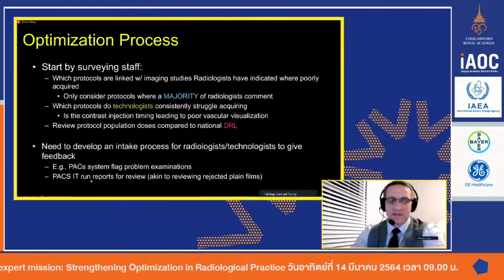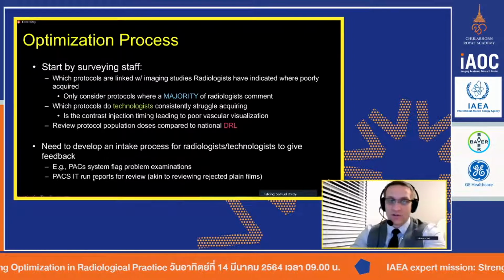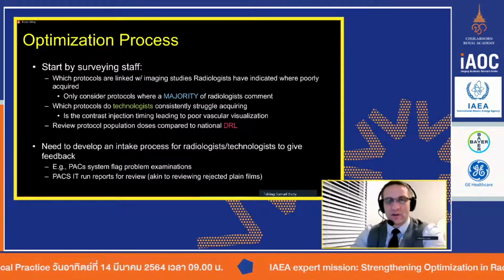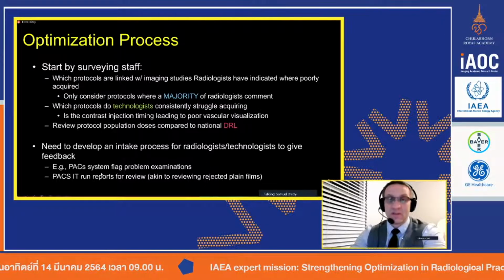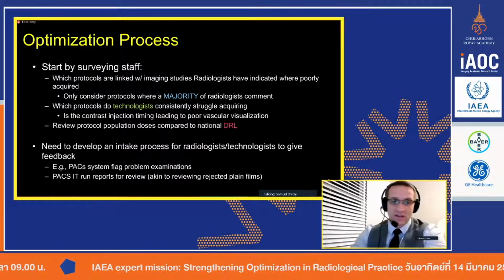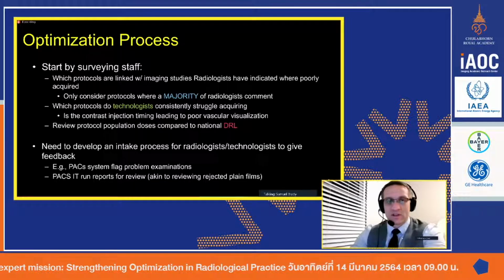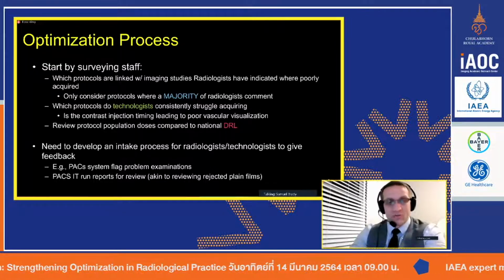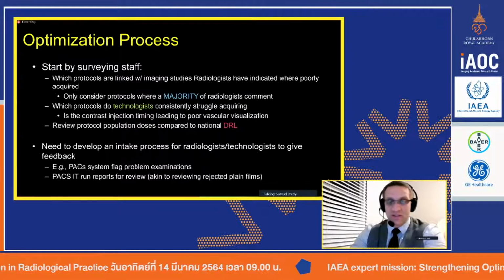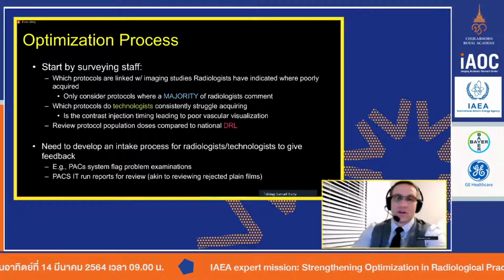And that really just depends on the technology that you have available. But if you do have it, I highly encourage, reach out to your PACS IT team, find out if you have that feature available on your PAC system, because it really does make a big difference. And there are a lot of papers out there. You can actually just kind of Google this concept. I've read several papers in preparing for this talk. There are several groups out there that have been doing this for many, many years, and they have seen great success in making sure their image quality is consistent across all of their protocols.